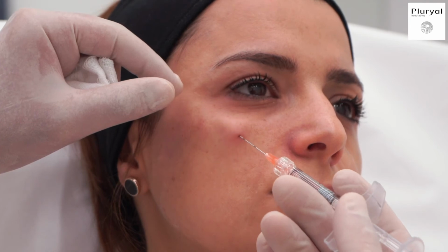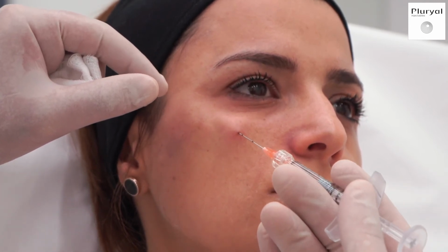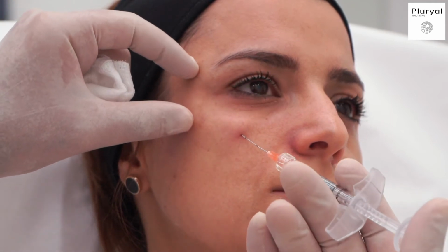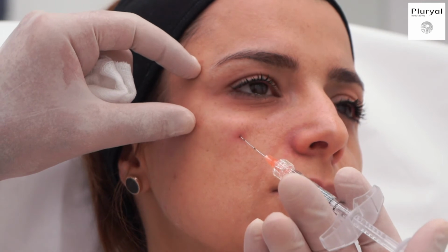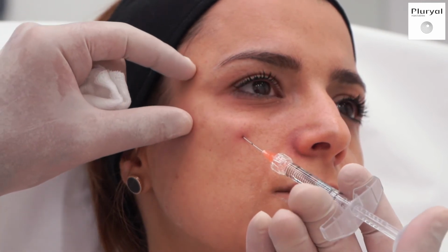There will be a point where you cannot pull up the cannula, it will be stuck. That's how you know that you're in the right plane. I go very deep when I do this.